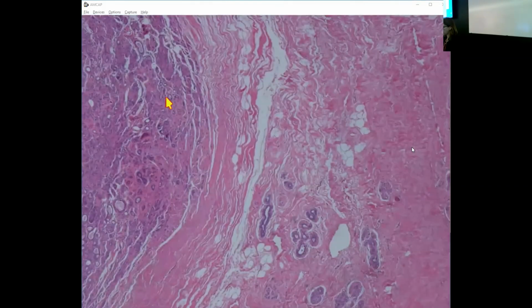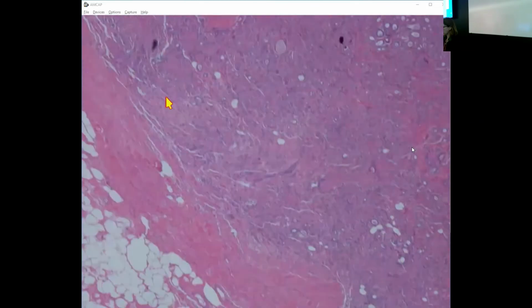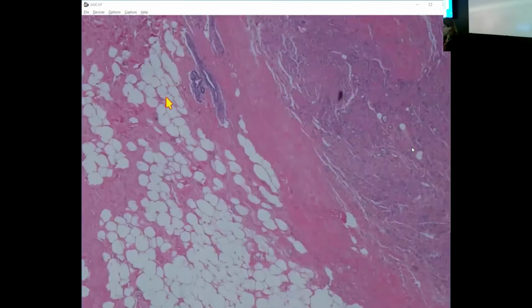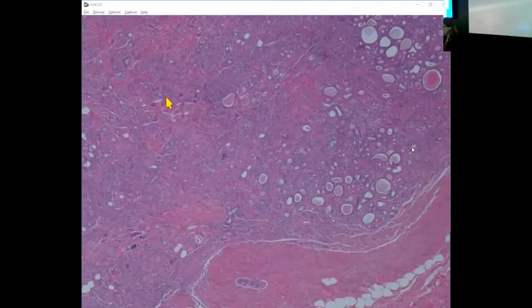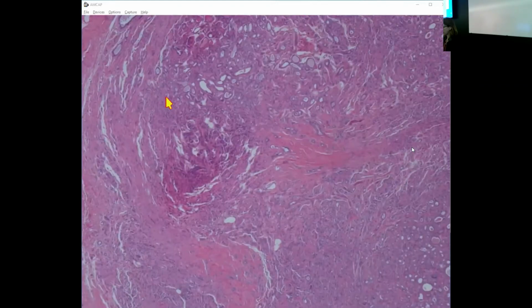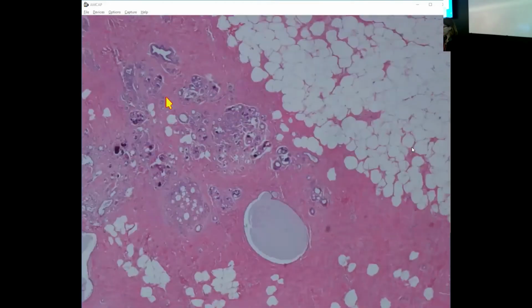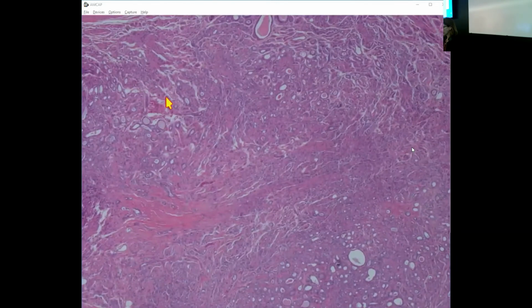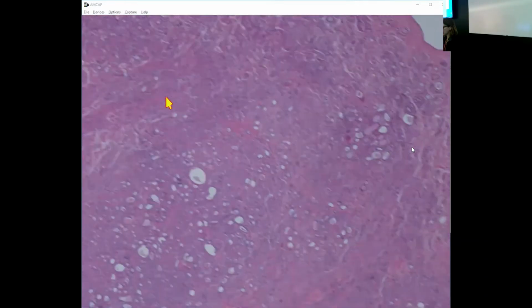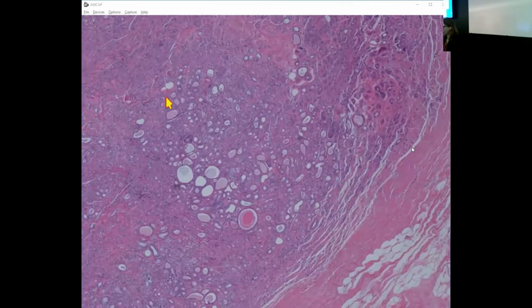Yeah. Another differential diagnostic consideration for small glandular proliferations. So this is a patient who had a breast mass that was excised. And you can see that mass here. Anybody want to sort of describe what we have here? Well, I will. So it's essentially the same kind of process that we just had. It's sclerosing adenosis, but it's coalescing into one big mass.